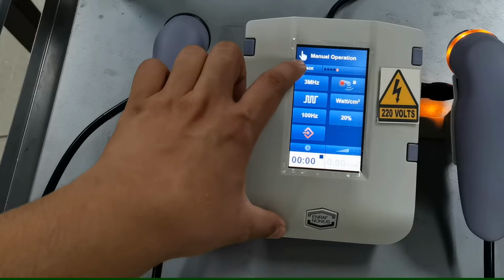So once you have set up all of this, and you've chosen the ultrasound head to be used, you click here and then you manually input the time. The usual or recommended duration for ultrasound is 5 minutes. Then after which you set up the intensity.